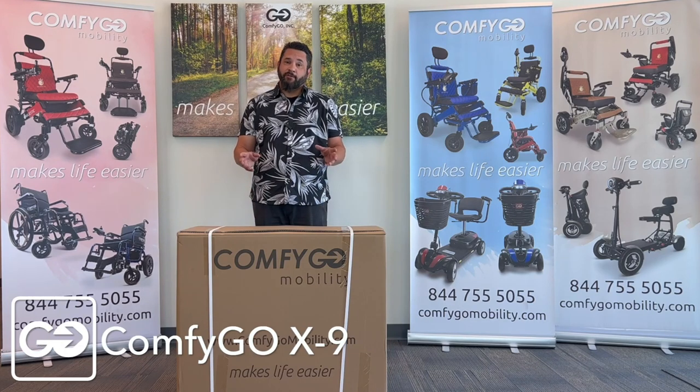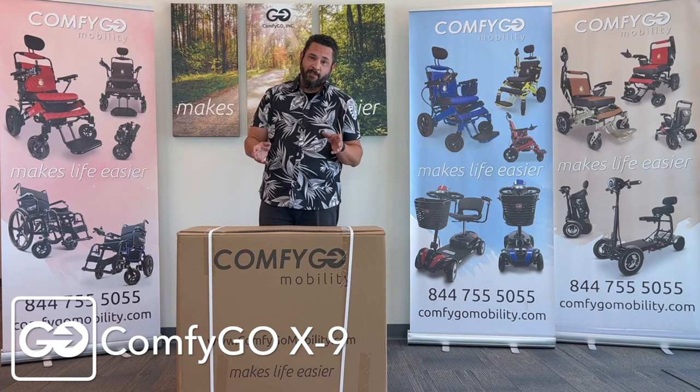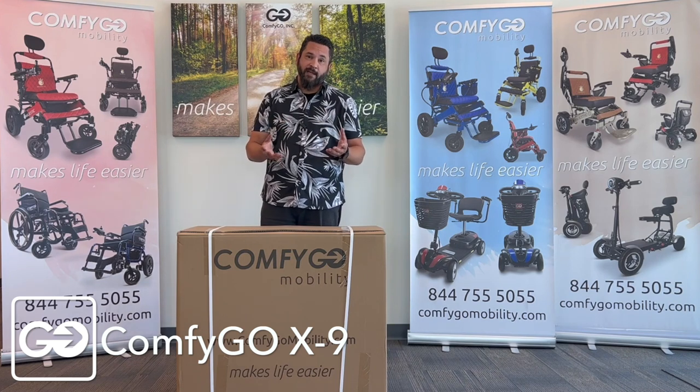Hi, I'm Joe with ComfyGo, and in this video today, we're going to show you the X9 wheelchair. We're going to open up the box today, take out the parts, and show you the assembly of the X9.